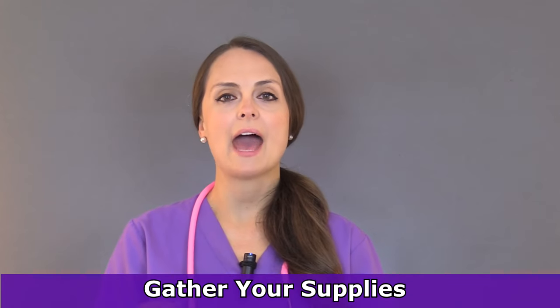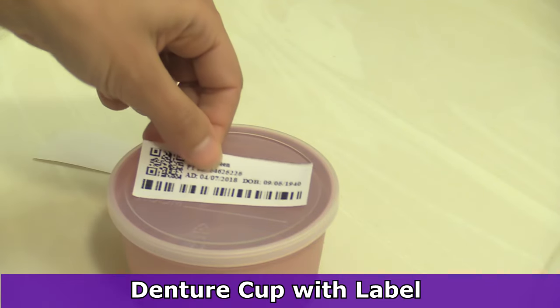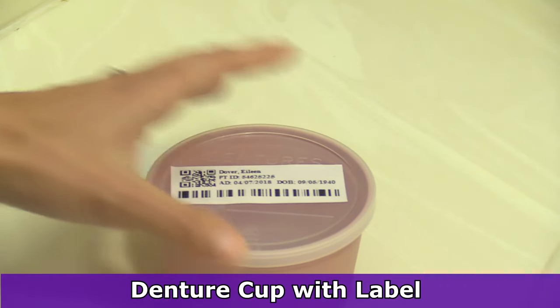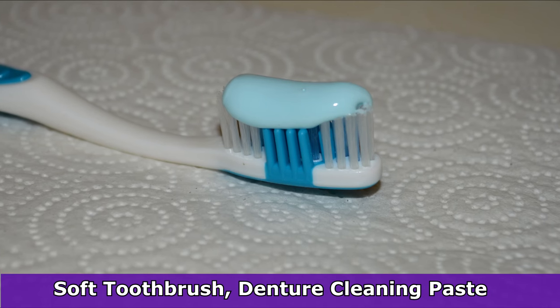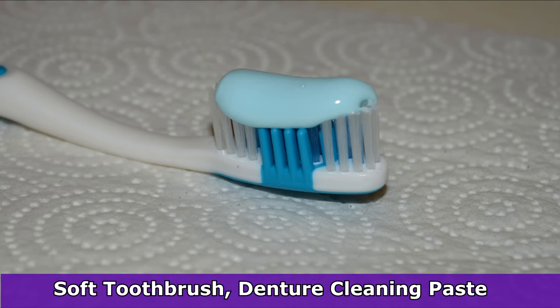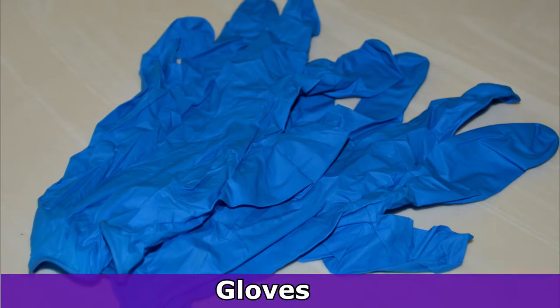First, you want to gather your supplies, which will include a denture cup. You'll want to put a patient label on the denture cup — on the lid — or write the patient's name and room number so they don't get confused with any other person's dentures. Also, a soft bristle toothbrush with cleaning paste for the dentures. It's really recommended that you use a denture cleaning paste instead of toothpaste because that can be abrasive to the dentures. A kidney basin, towels, paper towels, and gloves. Also be sure to ask the patient if they brought any of their own denture cleaning supplies, as some patients may prefer you use theirs.